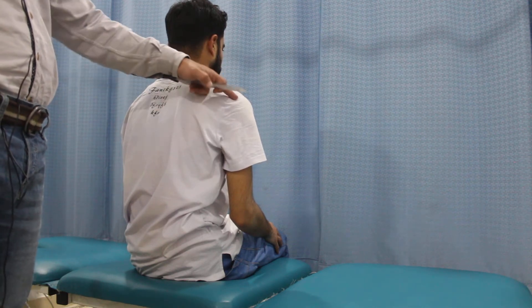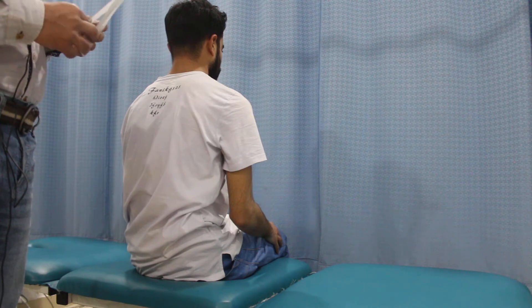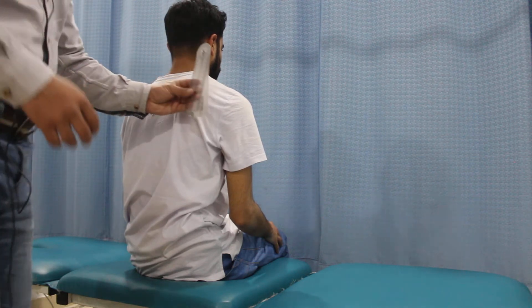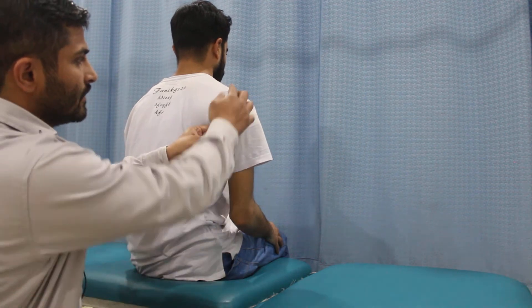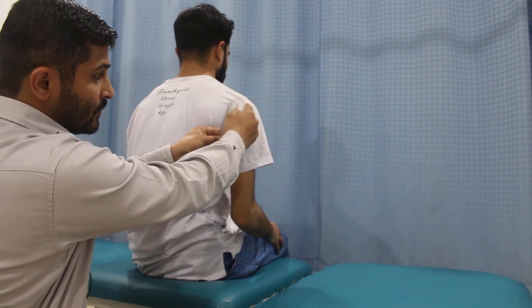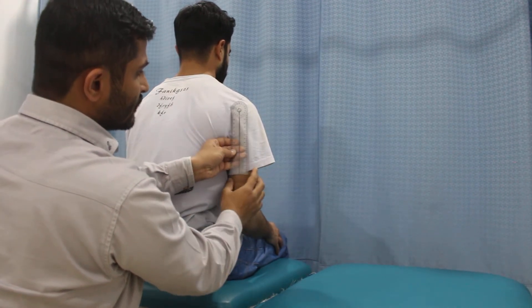First of all, I need to place the goniometer like this, and the fulcrum should be in alignment with the glenohumeral joint. This is the starting point, which is zero degrees or 180 degrees.